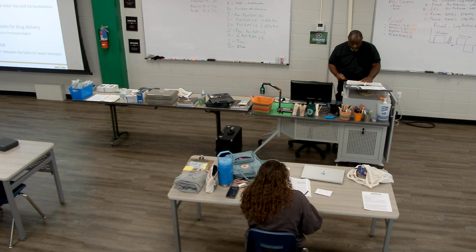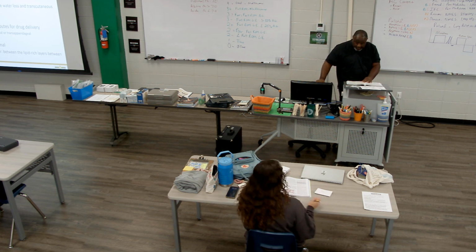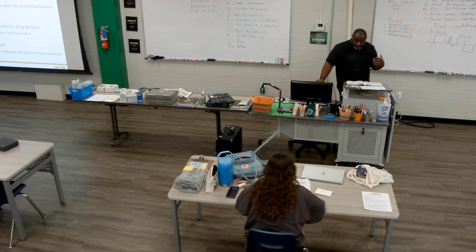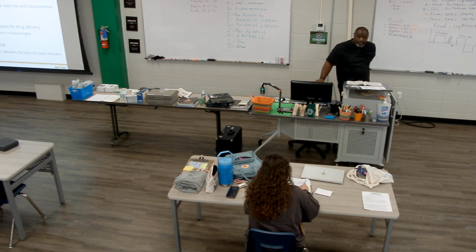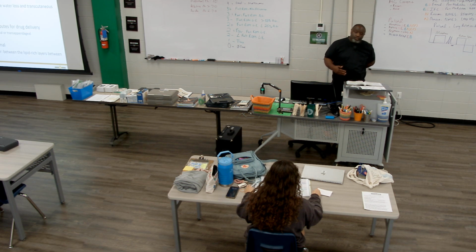Okay. So that leads us to iontophoretic. We talked about passive drug delivery. We won't go back there. It says under that iontophoretic enhancement, iontophoresis is the use of a small amount of physiologically acceptable electrical current to deliver drugs into the body. That's his definition. Small amount of acceptable current that helps to deliver drugs through the transappendageal route into the body.